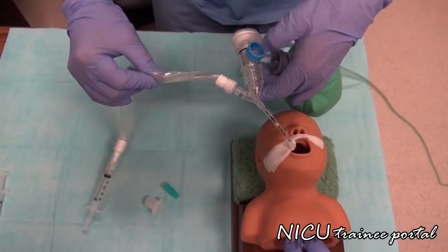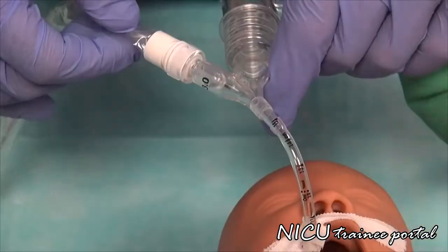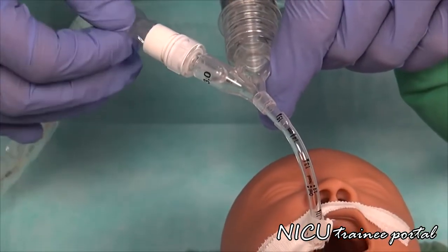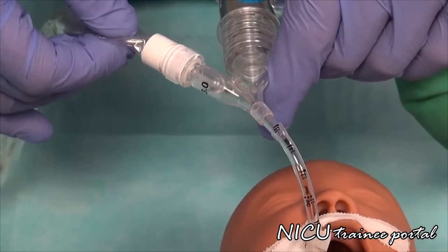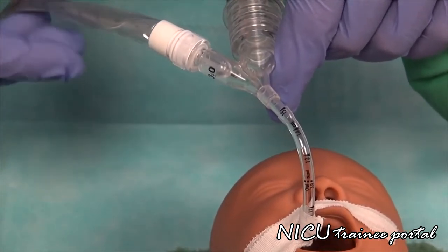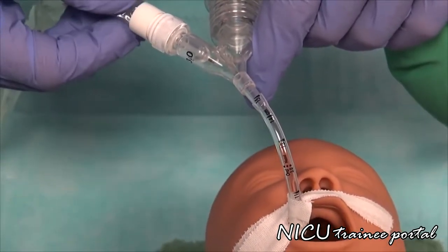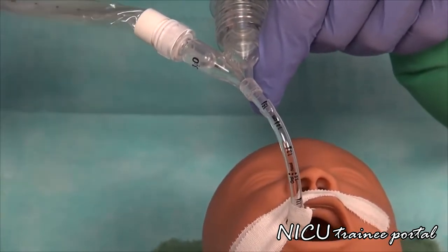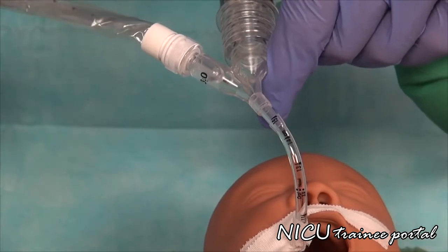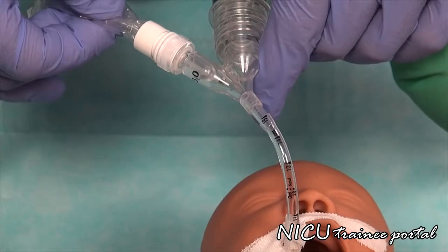Here we take the catheter, stabilizing the ET tube. So here we will insert the catheter, matching up the markings on the endotracheal tube to the proper markings on the catheter. I will be matching up the 14 on the endotracheal tube. I will be looking for the 14 on the catheter, which will be telling me that I am at the end of the endotracheal tube.